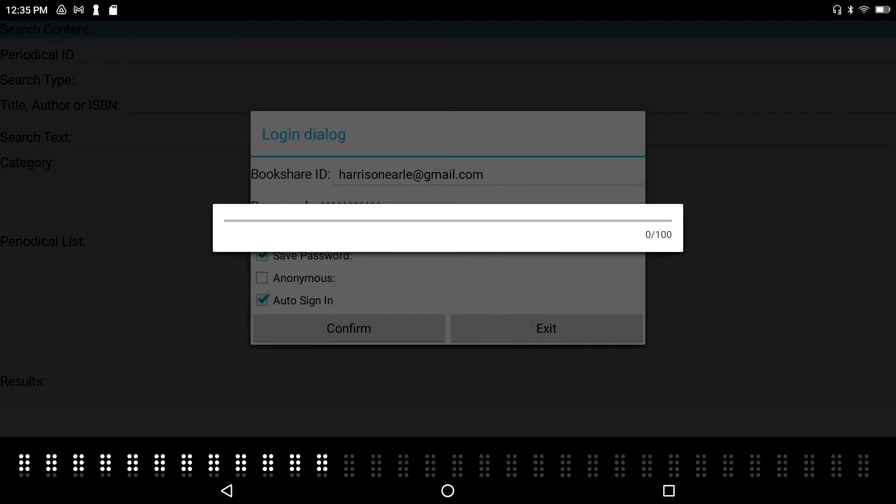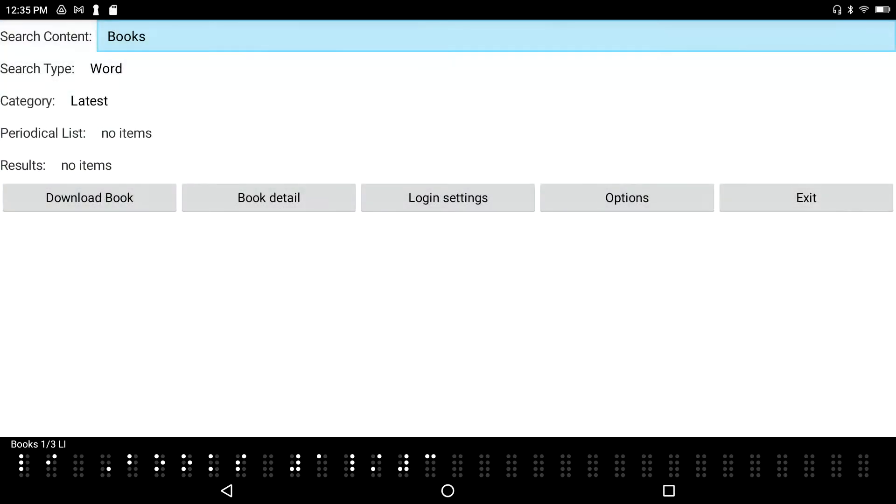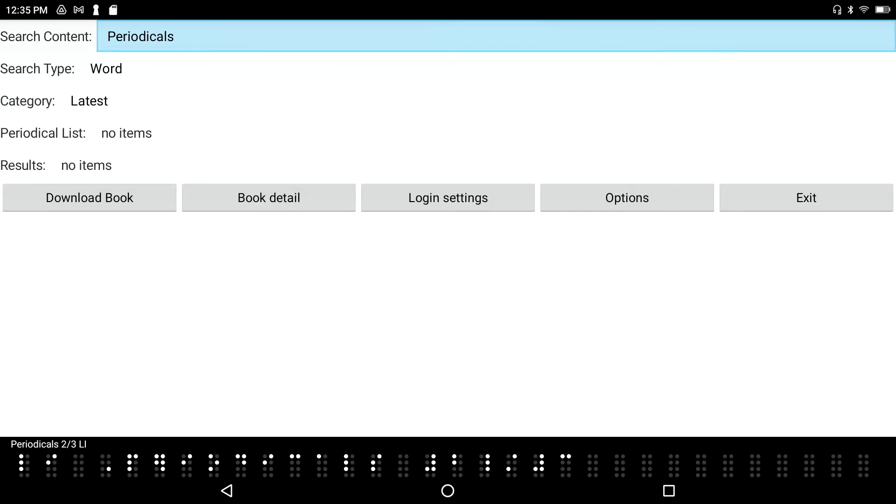That is the app logging me into the Bookshare website. Login success. If I down arrow space dot 4 through the choices in this list, I've got books, periodicals, and history. Let's go back up to books and tab. That's F3. Search type.